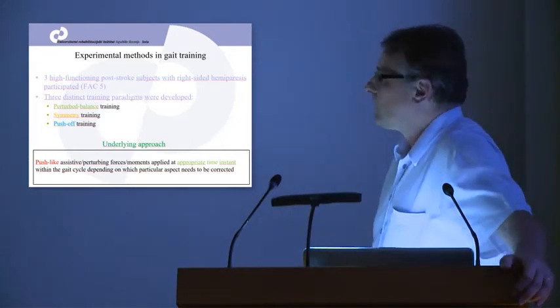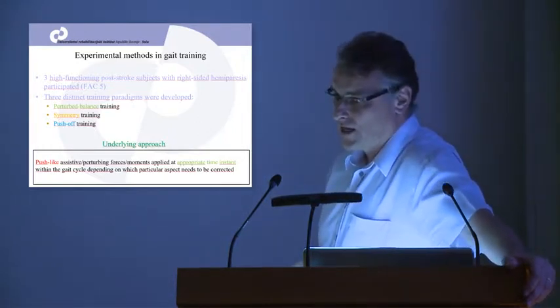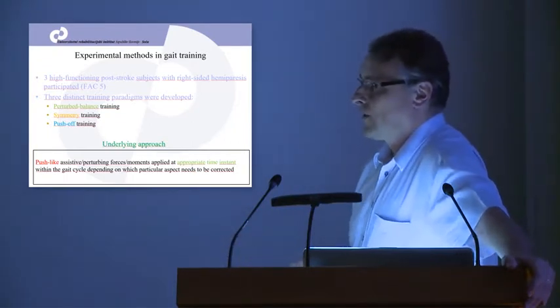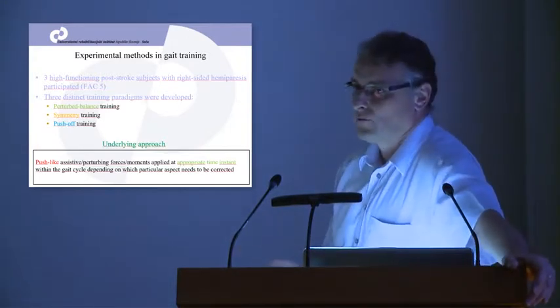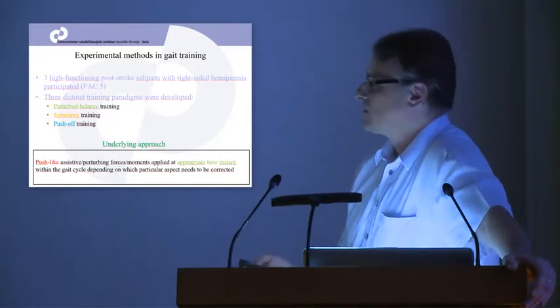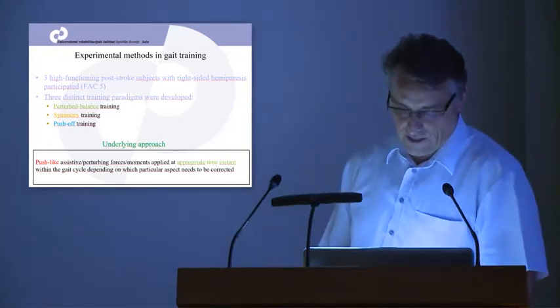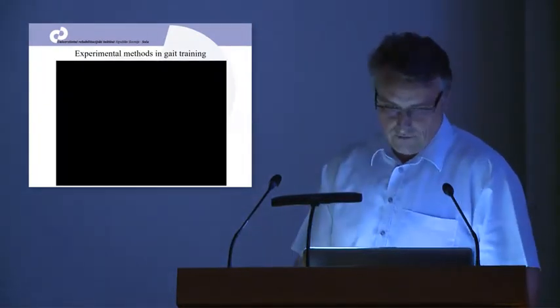The underlying approach that we think is novel is that we would like to implement what therapists do in their daily work. If you observe a therapist walking alongside the patient over ground or on the treadmill, when they are addressing insufficient weight bearing on the impaired side, they gently push the subject to that impaired side when entering the stance phase. So this is the underlying approach: push-like, assistive, or perturbing forces applied at an appropriate time instance within the gait cycle, which depends on the particular feature of walking that we would like to address.